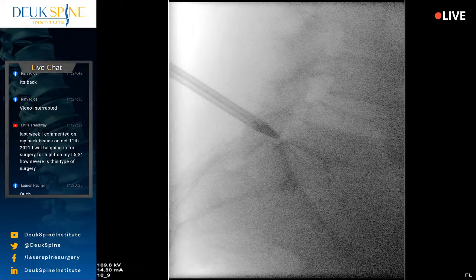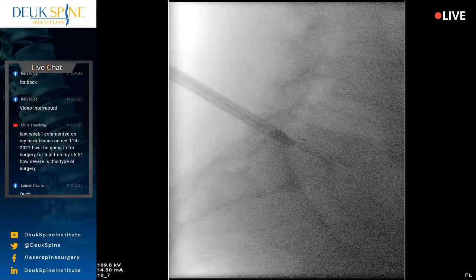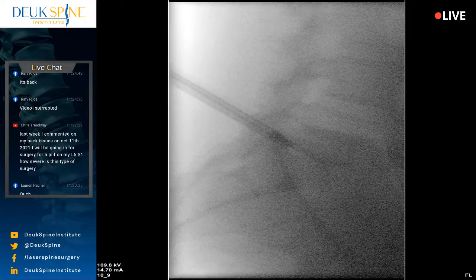And I'm going to try to push this herniation back in the disc where I can retrieve it safely. Okay? So I'm pushing the herniated nucleus back through the tear and back into the disc. We call it a reverse herniation.